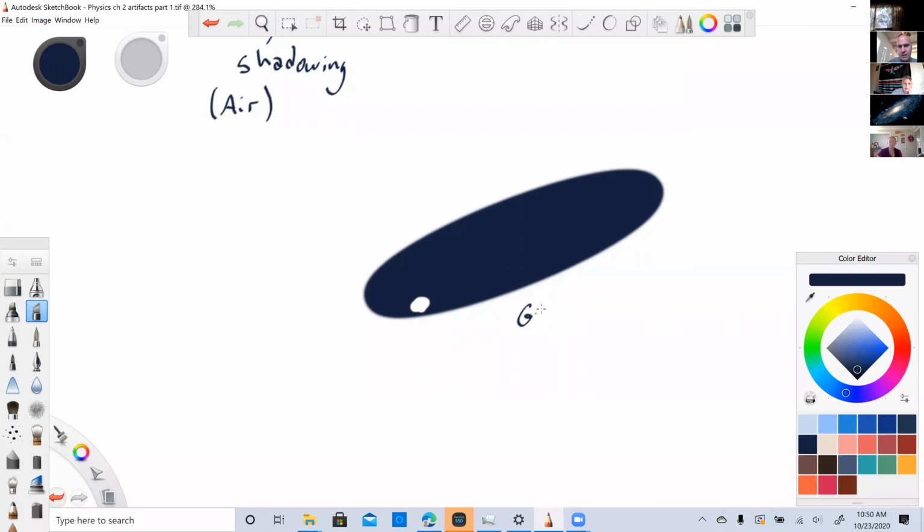I have here a gallbladder with a gallstone. And one way we know that it's a gallstone and not simply echogenic bile, which happens too, like little balls of bile, which by the way, probably will turn into stones. We had pregnant patients. Pregnancy changes your physiology and you're more likely to create gallstones. And I had a student in my first class here in El Paso. She was pregnant.